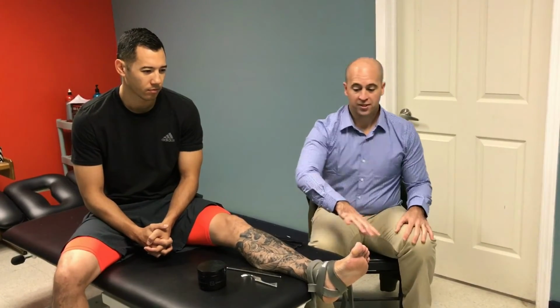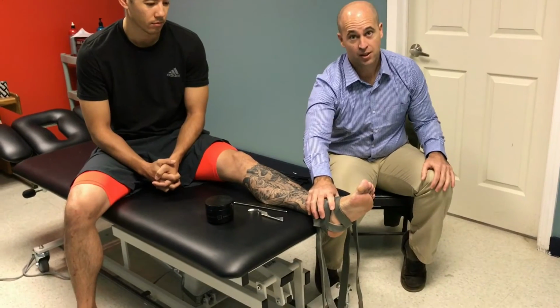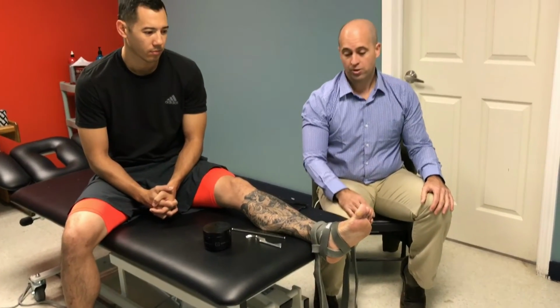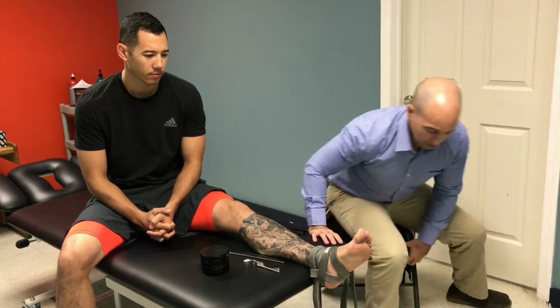So what we did is we have this setup here where we have some bands around his ankle, I won't say tight, but supportive around the ankle. And we're going to distract the ankle and have Justin move the ankle to get these muscles firing again.